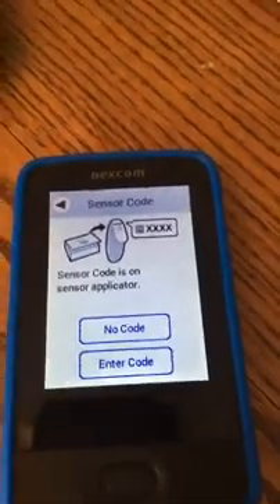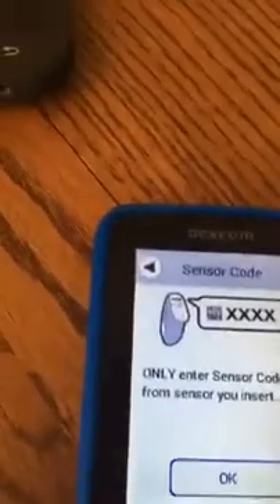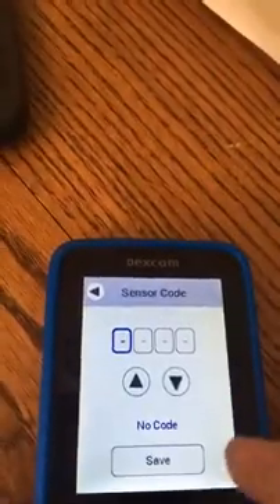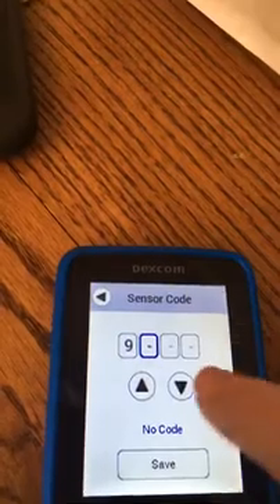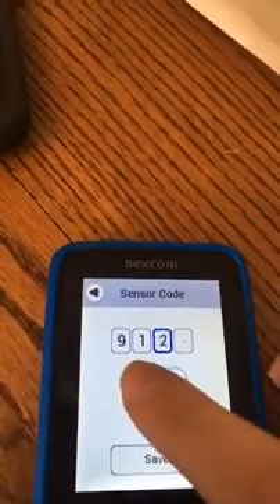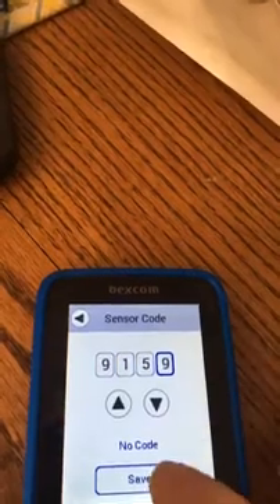Get an alcohol swab and clean off the area where we're going to put this. The sensor code is 9159. This is super easy — I figured out how to do this the first time.